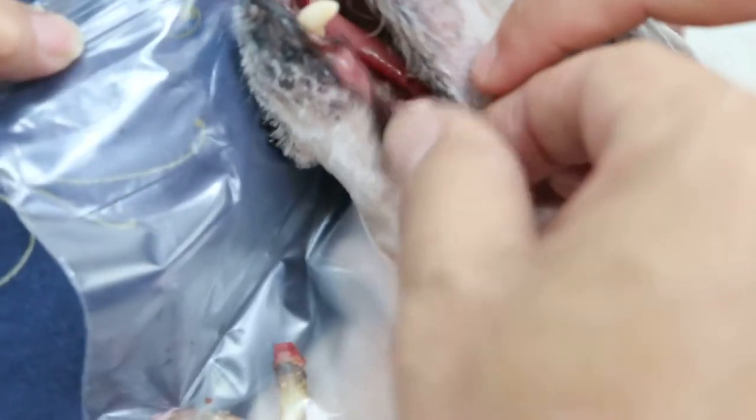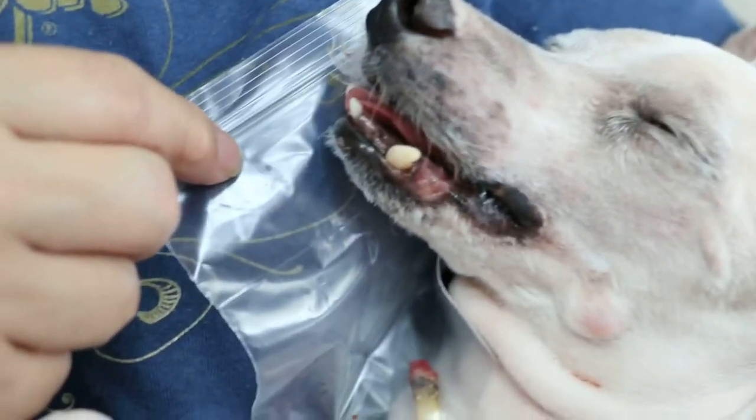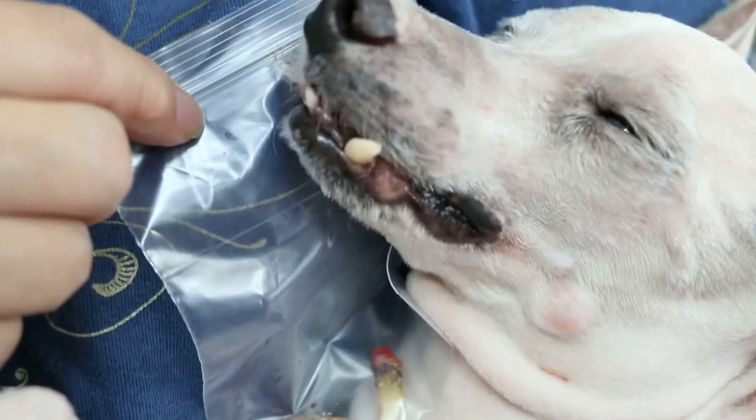Now, there's another one below. There's another one below here. I can just pull up here. Further back a bit, further back a bit. Also loose, so it's best to extract it rather than just do dental scaling, and then it will come back again, the bad breath.